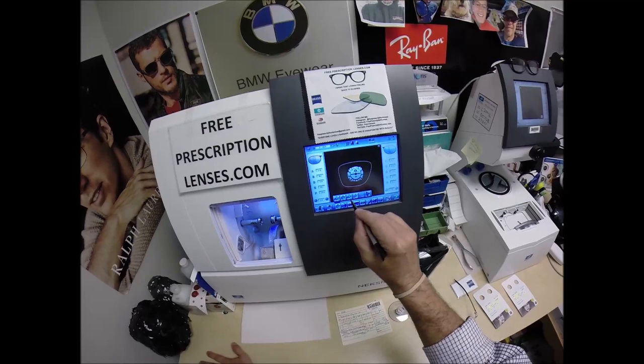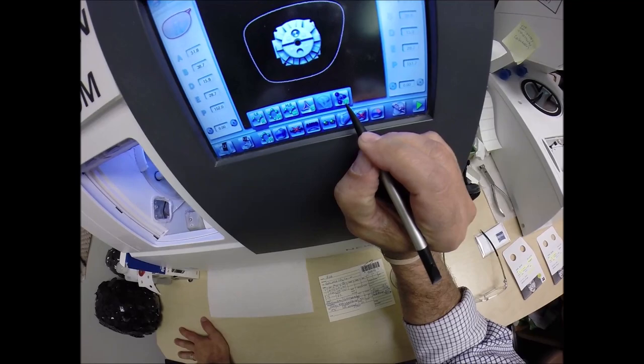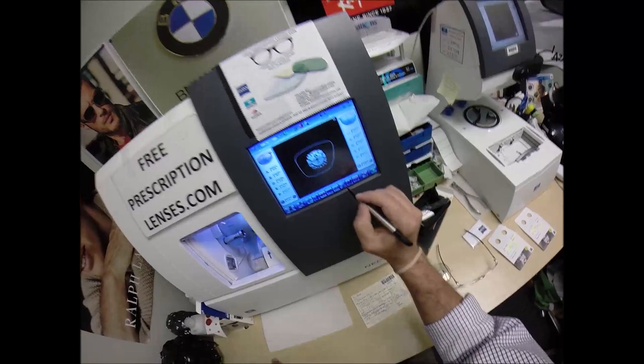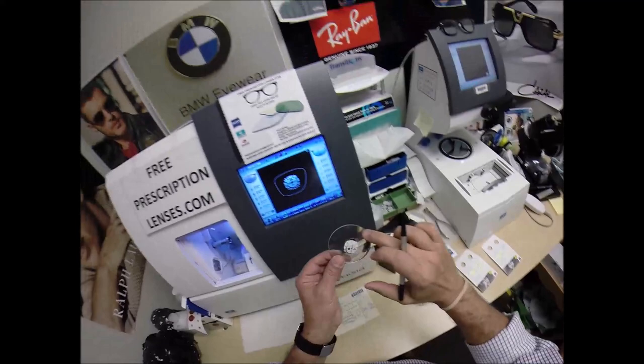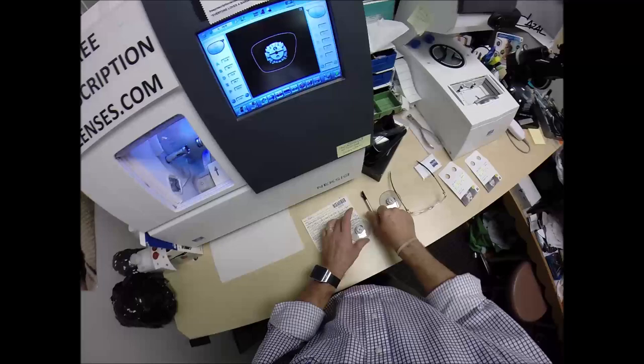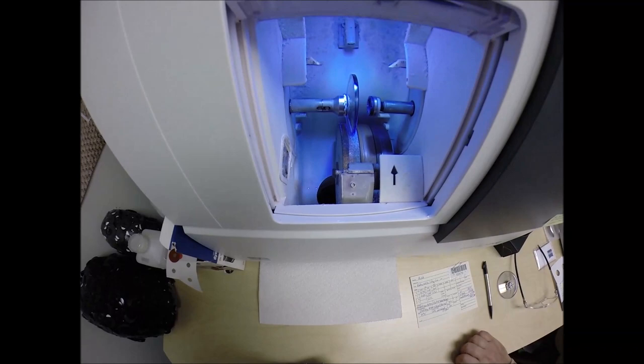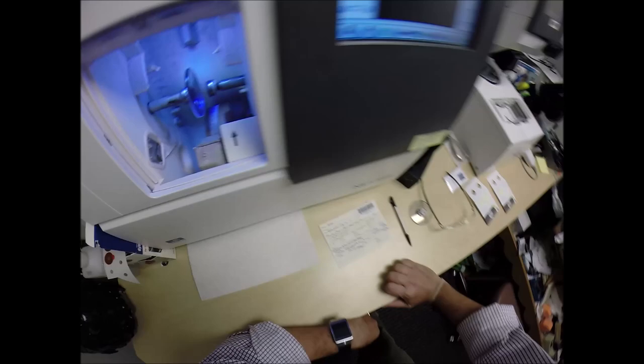These are polycarbonate lenses. If they were plastic, high-index plastic, or Trivex, I would select that accordingly. I'm not going to polish the edge of the lens because it's not going to be seen. I'm not going to put a safety bevel on the front convex surface, but I am going to put one on the rear concave surface of the lens. I'm going to press the sticker on there firmly — the magnet's going to attach itself to the chuck. Hit the start button, the door closes, the clamp shuts.